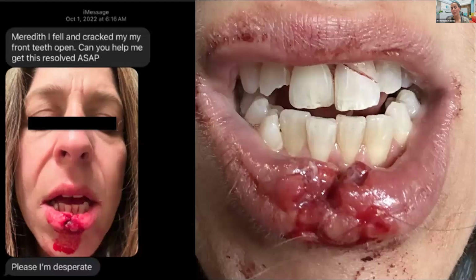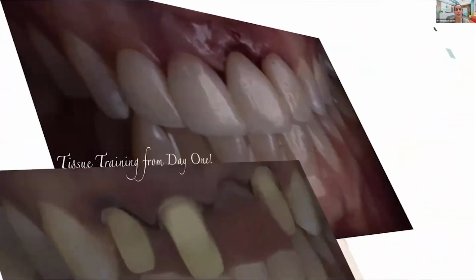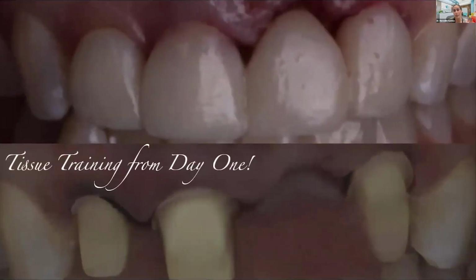So Carla comes in, we take a CBCT, we realize 9 is going to be non-restorable. We're going to have to do an implant there. I believe 8 ended up needing a root canal. And then of course 7 and 10 have some fractures. So this is completely assistant driven.